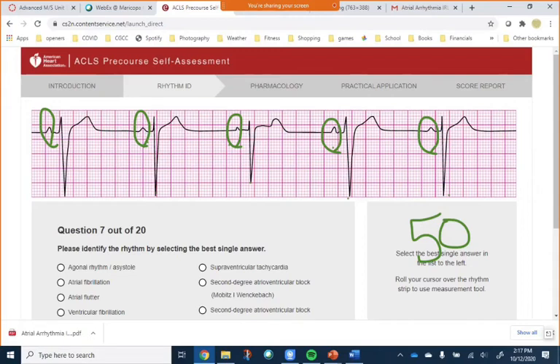And let's look at the PR interval. Let's get one that's on a line. I like looking for ones that start on a line. This one's kind of starting here and going into here. So we have 1, 2, 3, 4, 5, 6. This one's kind of starting here and going to here. 1, 2, 3, 4, 5.